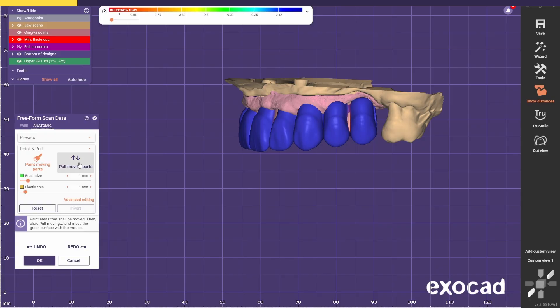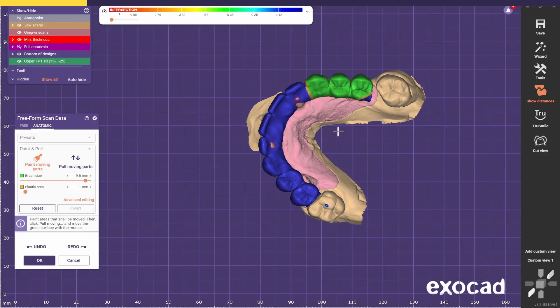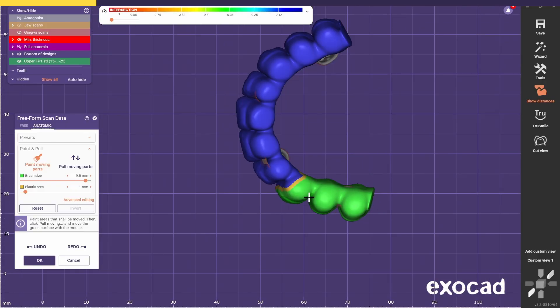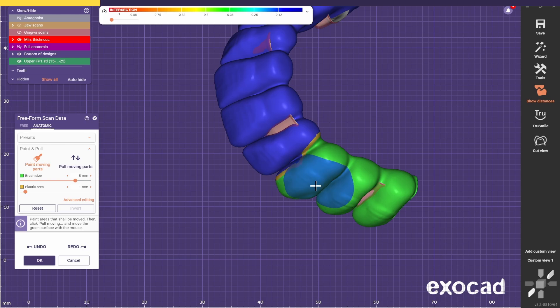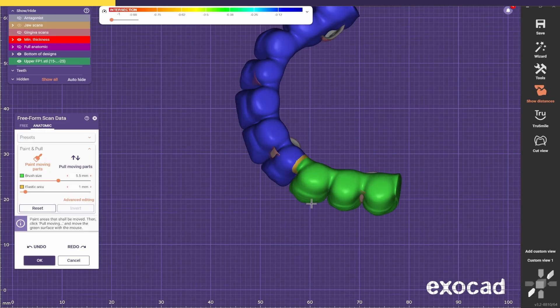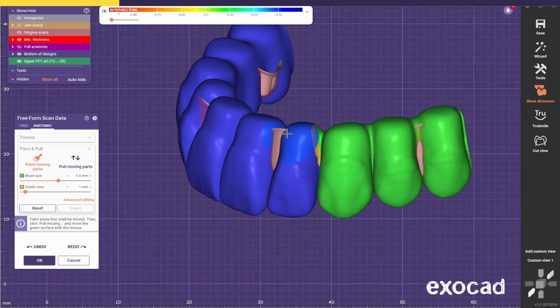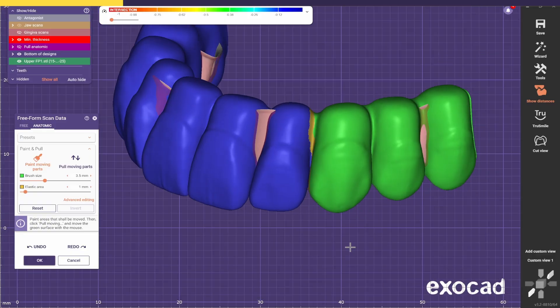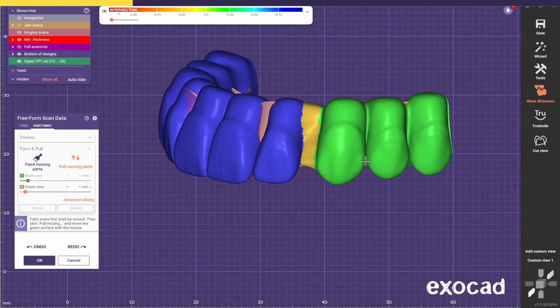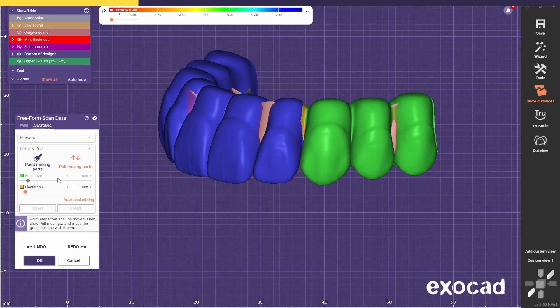It's always easier if we use the paint and pull technique. I'm going to paint everything that I want to move — everything that is green is going to move, the yellow part is going to deform to accommodate the changes, and the blue part is going to stay in the exact same position. If we don't make the yellow part a bit bigger, you're going to see that it stretches just that tiny bit. So I always like to increase it as much as I can.